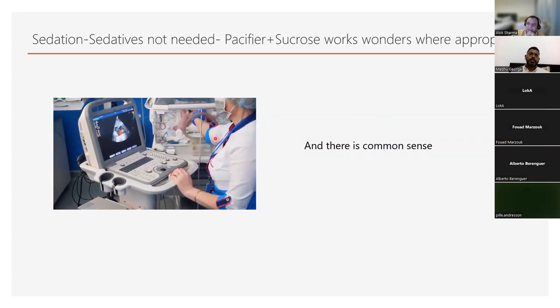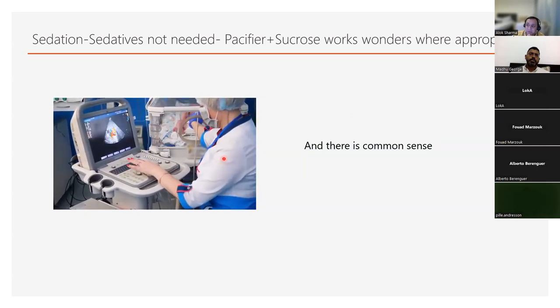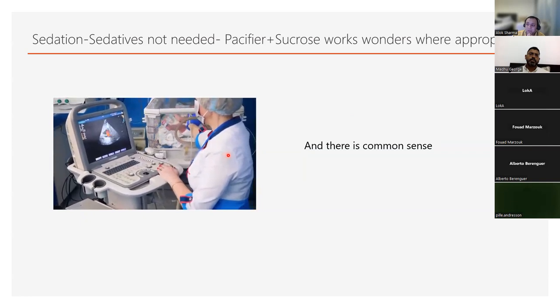This is trouble. This is real trouble. There's nobody helping this poor person. Now, can you see how the baby fights the hand? It's going to interfere with your ability to keep the probe in the right place. But more importantly, who's keeping an eye on the baby? Now, if this is a baby who's intubated, ventilated, and nobody's keeping an eye on the baby, sats are dropping, and this baby accidentally extubates, you'll be in big trouble.